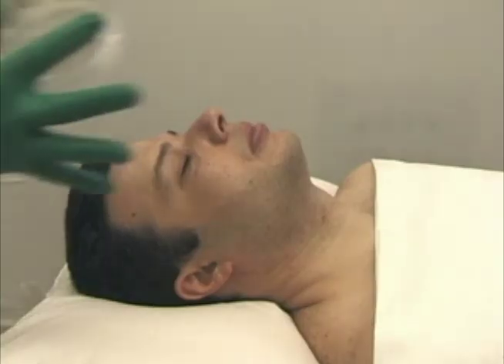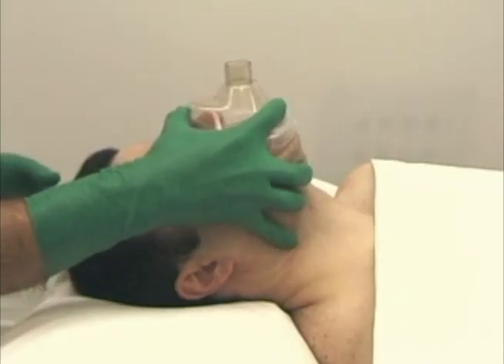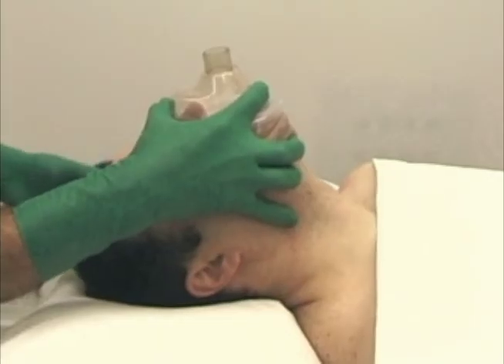The most common method to hold the mask consists of placing the thumb and index finger on the body of the mask while the other fingers pull the jaw forward and extend the head.